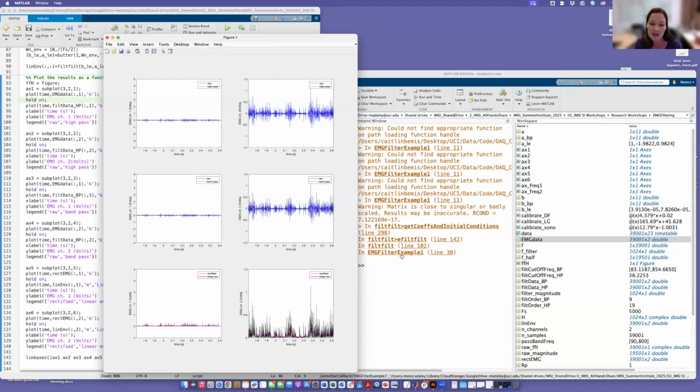And I don't have an example ready today, but one of the ways around that is a different approach to calculating a linear envelope using wavelets, where you use a bank of filters rather than just a single filter.